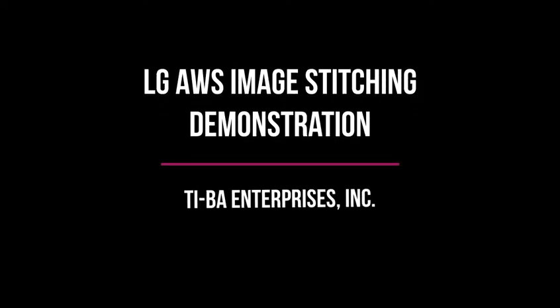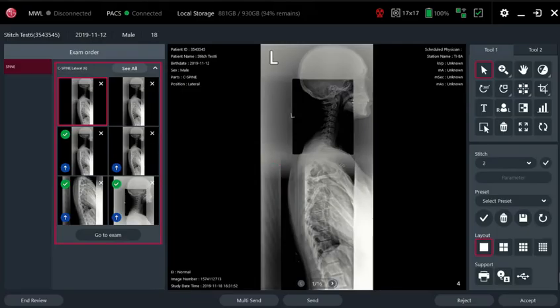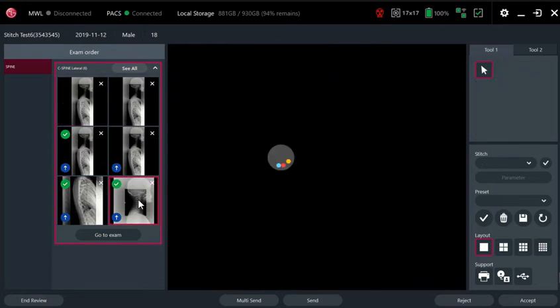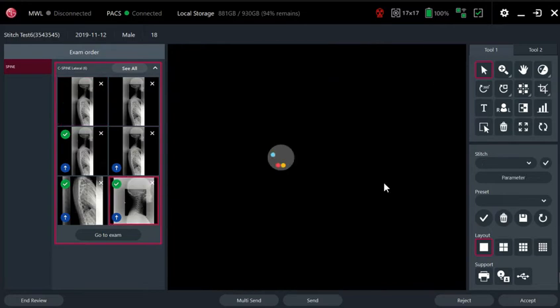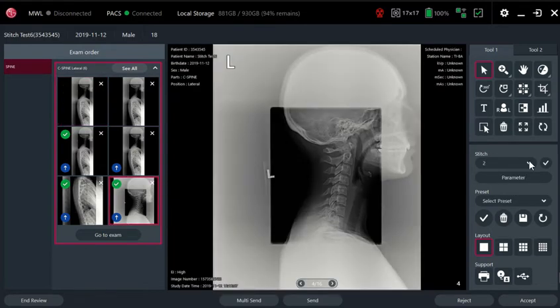In this video we're going to be demonstrating how image stitching is performed in LG's AWS software. We have a couple of cervical images here selected and we click on the stitch button.